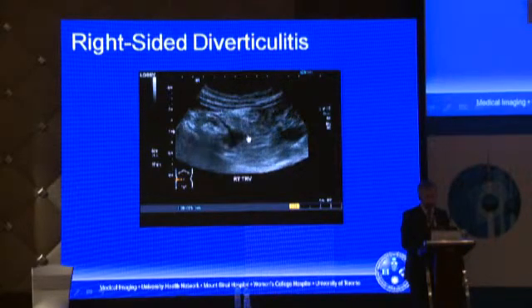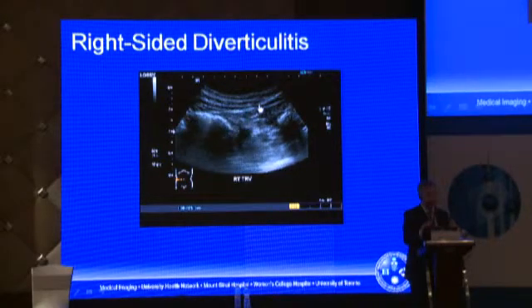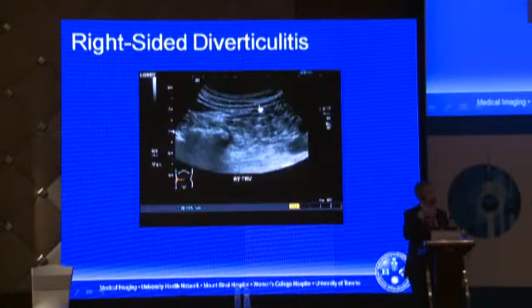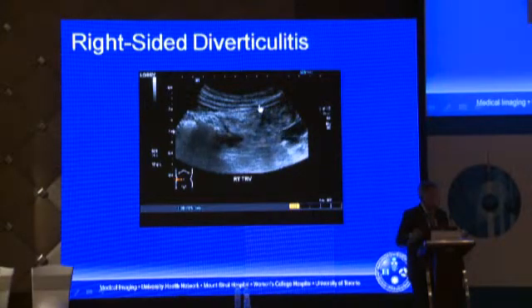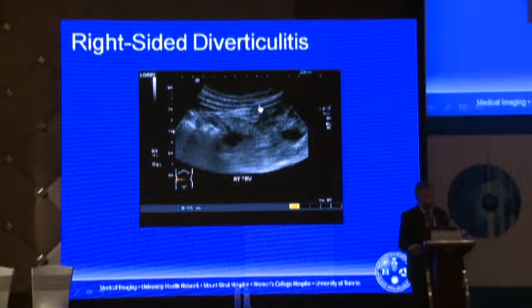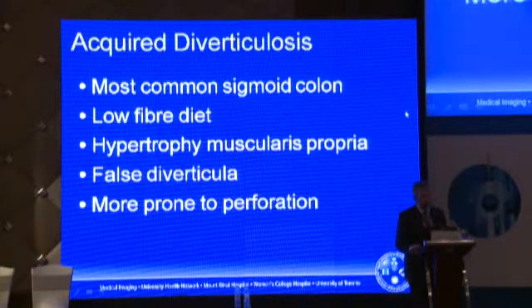The inflamed diverticulum with echogenic fat surrounding it. See how bowel loops are pushed away. And the patient can put their finger on these, you just pop the probe on, and often it'll become obvious as to what is happening.